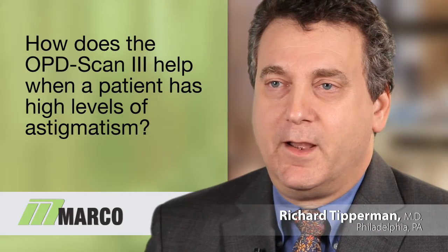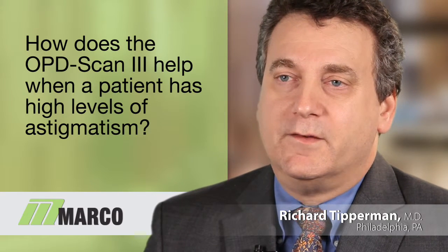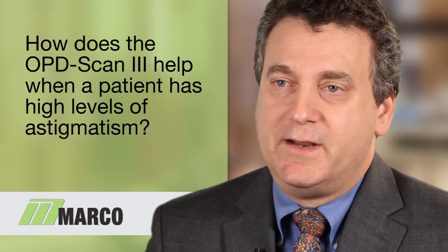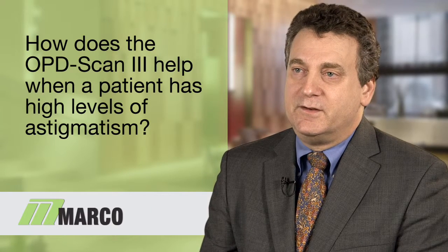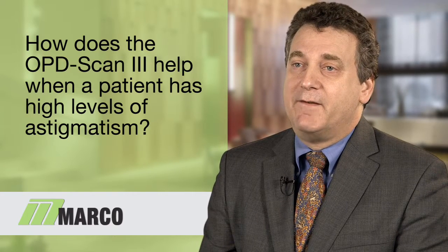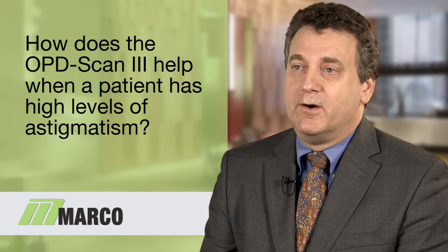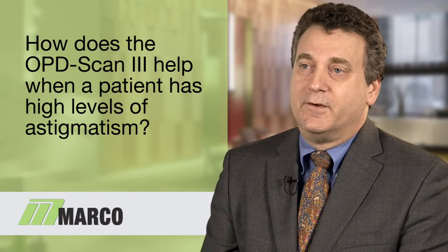The OPD scan can be very helpful when trying to make a decision as to what form of advanced technology lens is best for patients. Some surgeons are comfortable using multifocal lenses in patients with high levels of astigmatism, whereas others want to use toric lenses. And in many patients, they could potentially be a candidate for both. The OPD scan is especially helpful in a patient who's considering a multifocal lens, but then you look, and they have astigmatism, and you see that they have a fairly high level of higher order aberrations. So that's a patient where I'm very comfortable saying, well, I know you're interested in multifocal technology, but we're probably much better off going ahead with a toric lens. And it allows you to make that recommendation very comfortably for the patient.